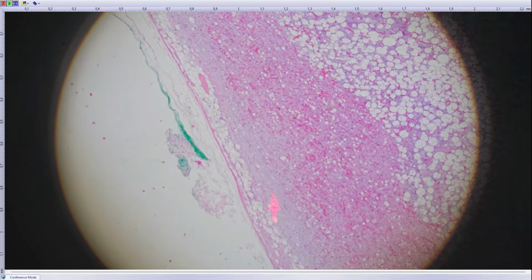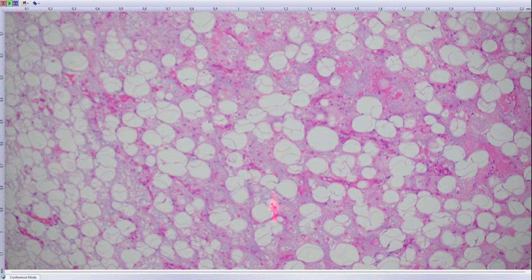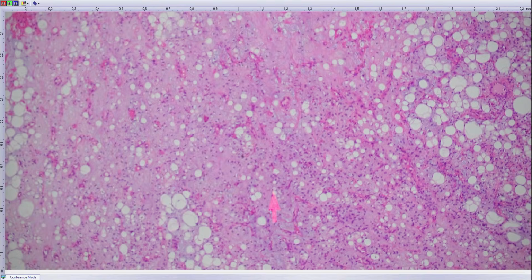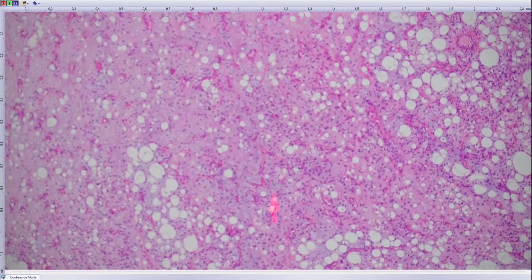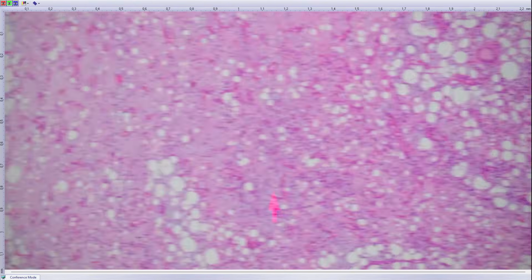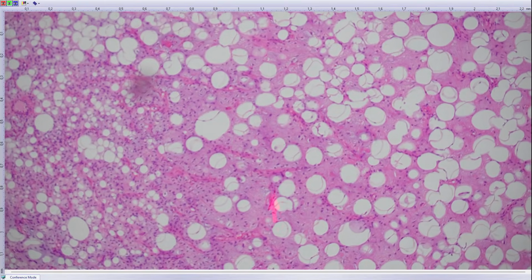Actually, at about the same time I received this case as a consultation, another lipomatous tumor, with kind of this bluish grayish background, myxochondroid a little bit, mature adipose tissue, and a lot of lipoblasts. The only thing that was different here was the vasculature, these prominent arborizing vascular channels, long slit-like vessels, which are typical for myxoid liposarcoma.